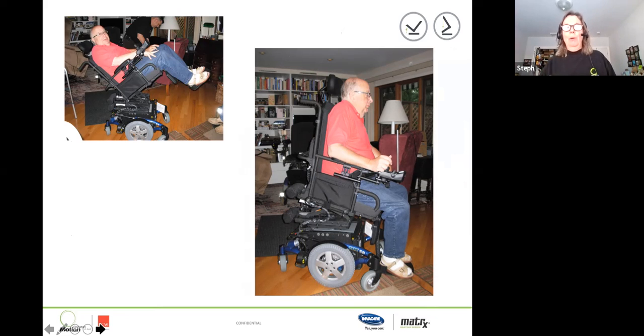So one would be, I think it was Rich. And so this is a gentleman who has multiple sclerosis, requiring powered mobility, still able to do a really scary transfer for this OT. Loved the ability of using traditional posterior tilt because it really let him get himself all the way back in the chair. He couldn't scoot as much as he had once been able to.